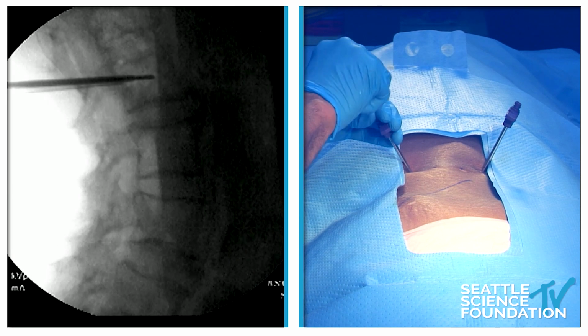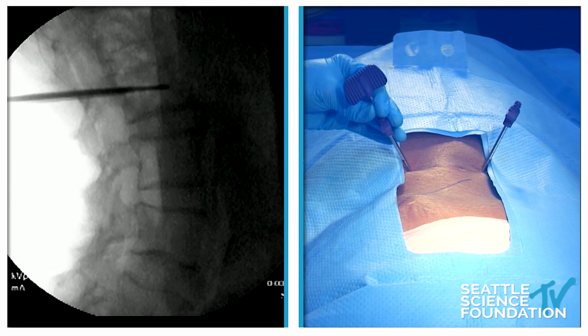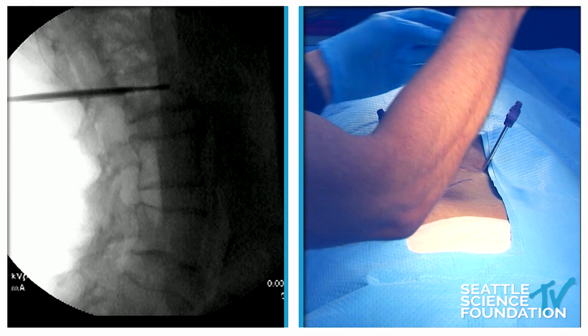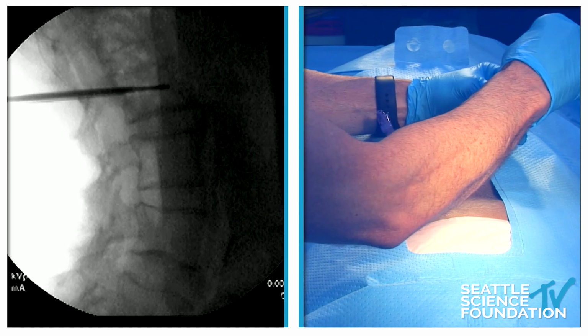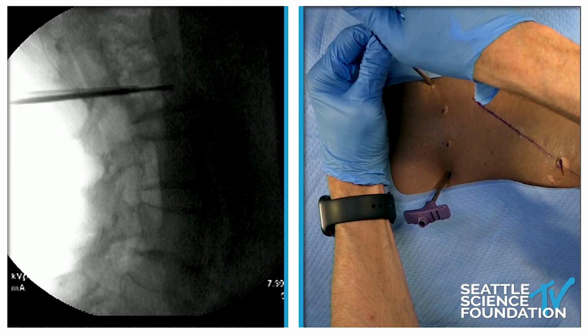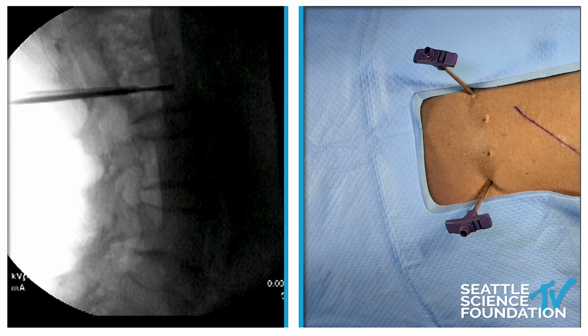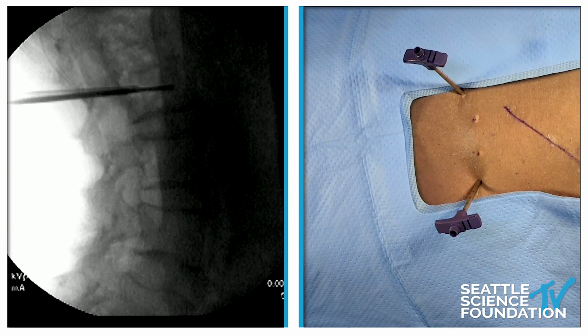Drill, and we drill to within 3 to 5 millimeters of the anterior wall. And we don't drill closer than that because we have to remember that this is curvilinear. And if we drill too far, we can be in no man's land and be out the side of the vertebral body. So we have drilled, and now we're going to balloon.